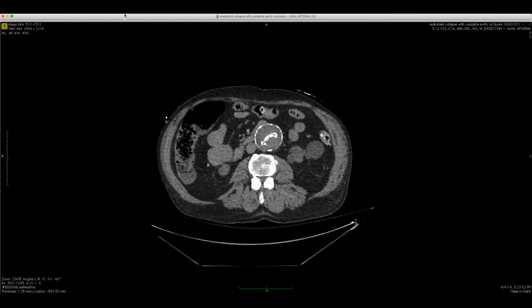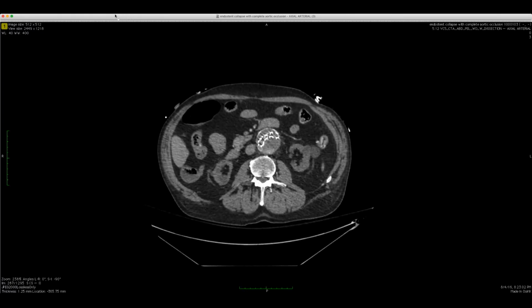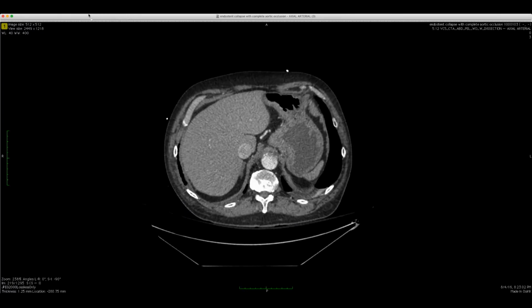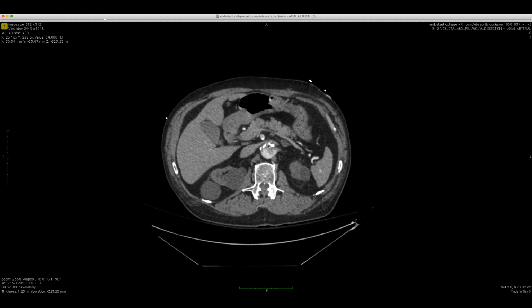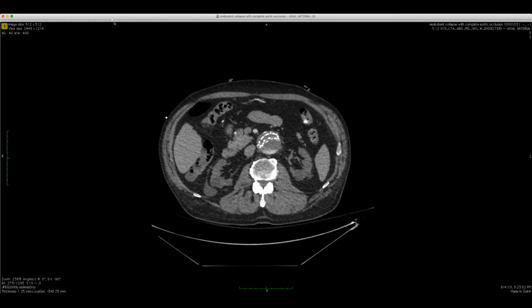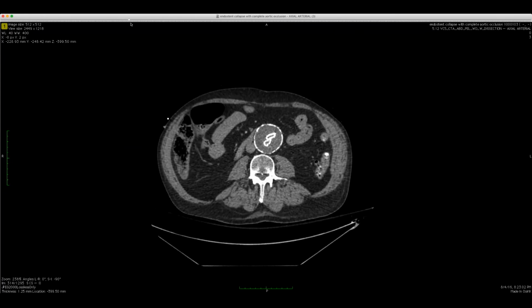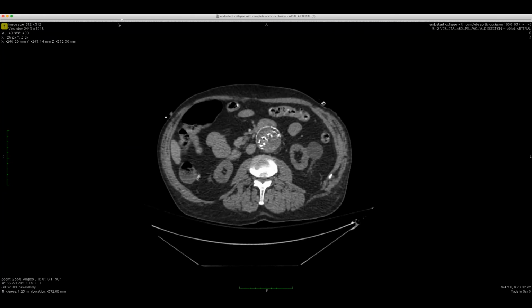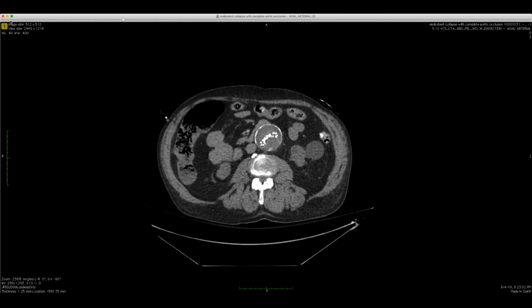I think one scenario is an enlarging aneurysm causing pressure to build up and then stent collapse. And this aneurysm had increased in size, but not that dramatically. So I'm guessing it's some combination of the new dissection, the fluid dynamics there, and maybe because the true lumen pressure head was diminished, since it's so compressed and narrow there because of the new dissection. Maybe all those things played into this. Whatever the cause, it was certainly a dramatic presentation. But that's all I have.